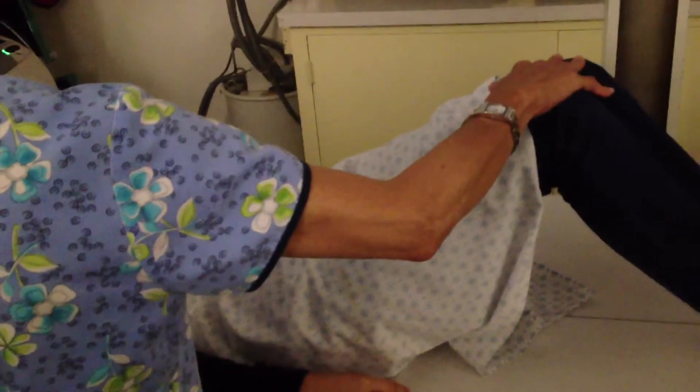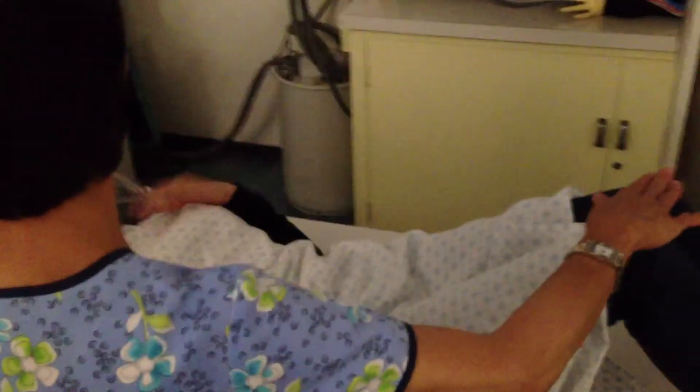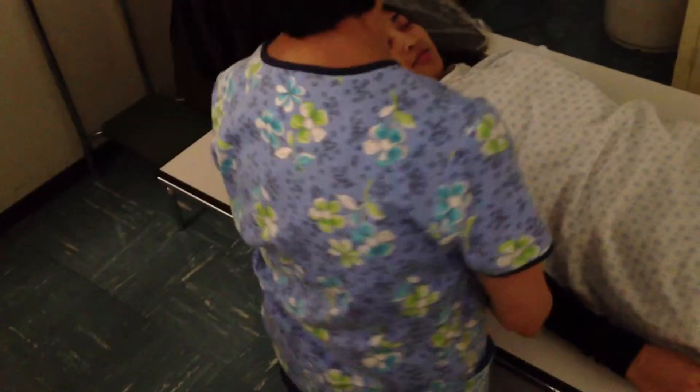I'm going to sit you up, Catherine, okay? And I'm going to do it really slow. Bring your knees down for me, please. She's on a gurney. I'm sitting this up — come up with it. I'm bringing up the gurney.